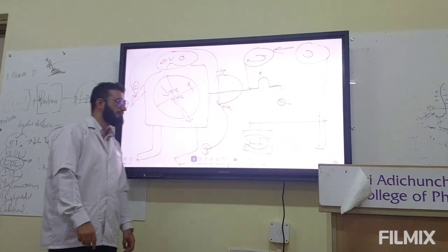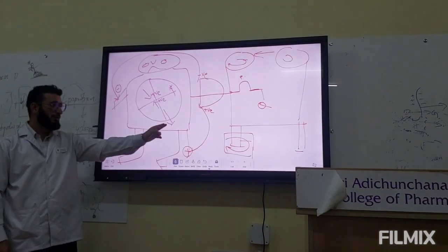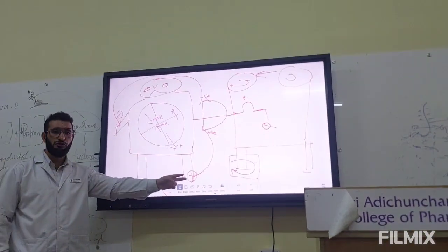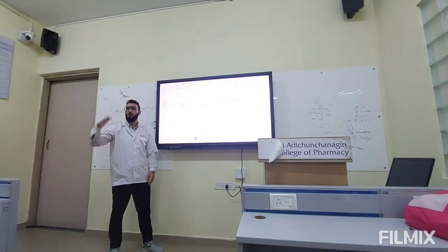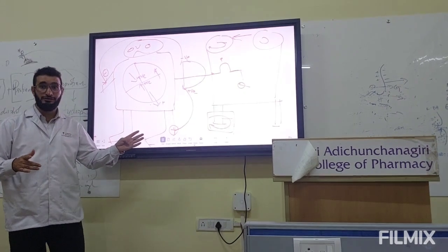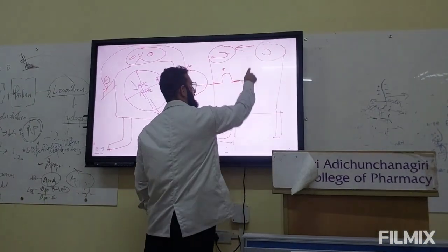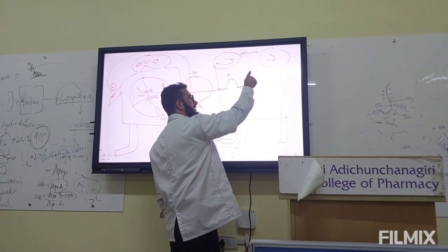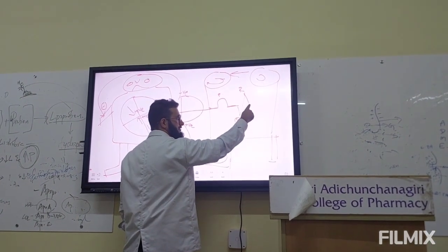Then the major ventricular depolarization carries positive charge toward the positive electrode. The myocardium is bigger here and produces a strong current, and it's a fast conductor. So the deflection is fast and bigger, like this. Which wave is this? R wave. Then the needle will come back to its position.